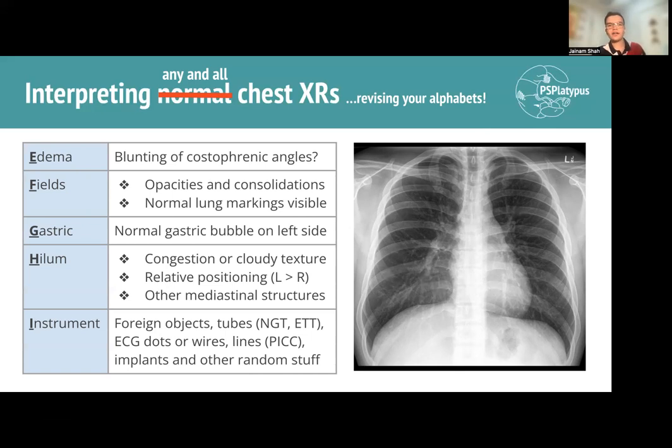So you might be wondering, okay, is this an emergency admission? They probably haven't had enough time, or this is such an emergency that they haven't had enough time to really take everything off the patient, take their clothes off, take the ECG wires off. They just have to do it really, really quickly. Okay, so that's the main couple of things that you're looking for when you get to a chest X-ray. And as long as you stick to the systematic approach, you will never forget anything important.